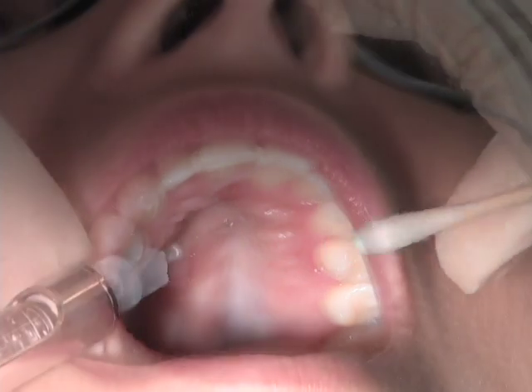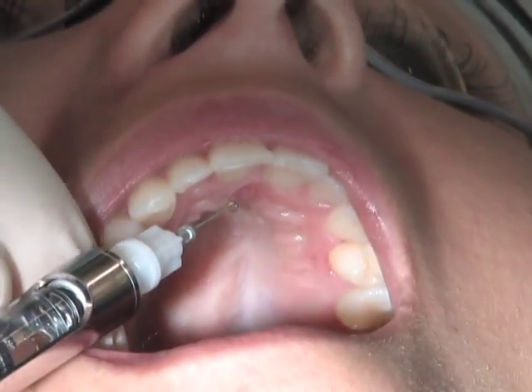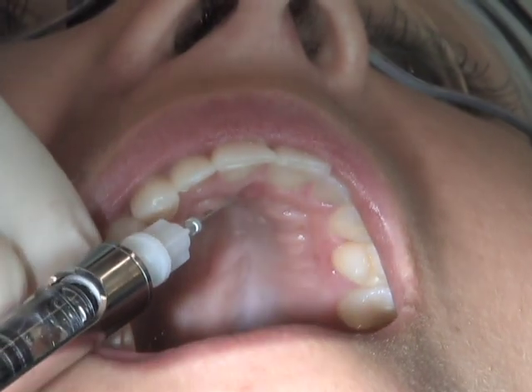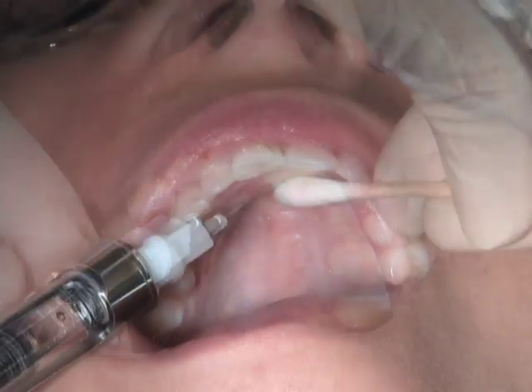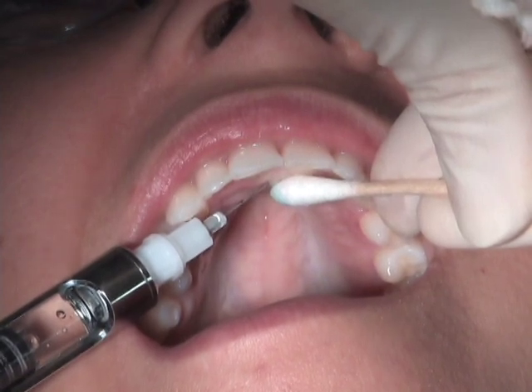The insertion site is at the lateral border of the incisive papilla, midway of the widest anterior-posterior portion of the incisive papilla. Remember that pressure should be applied prior to inserting the needle.